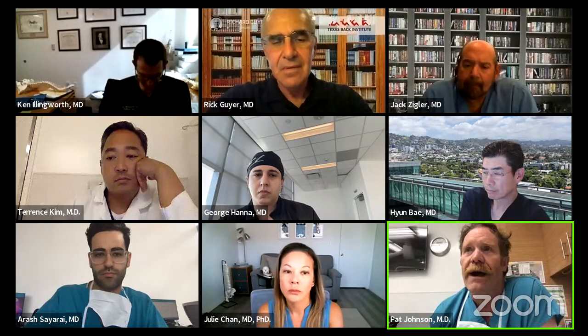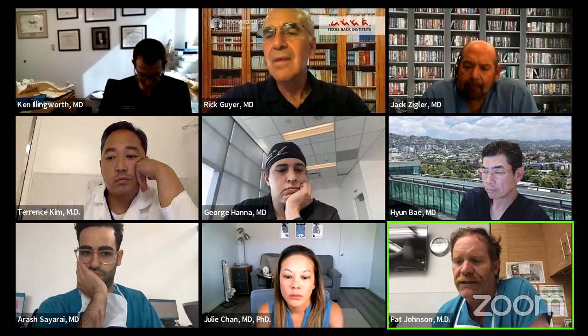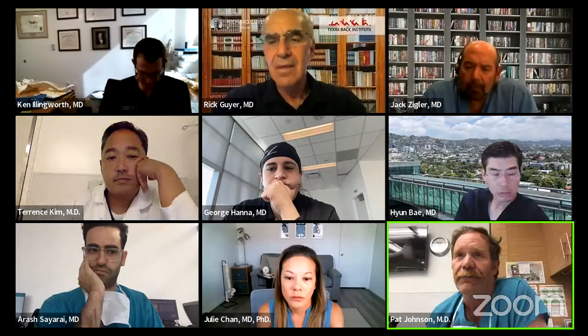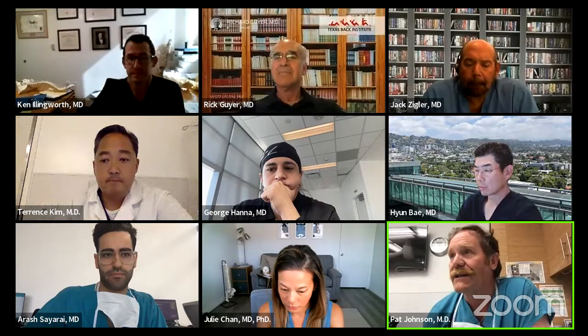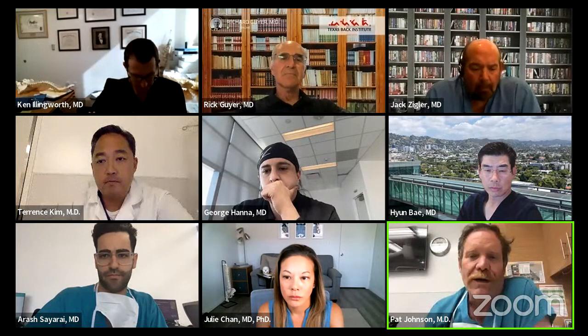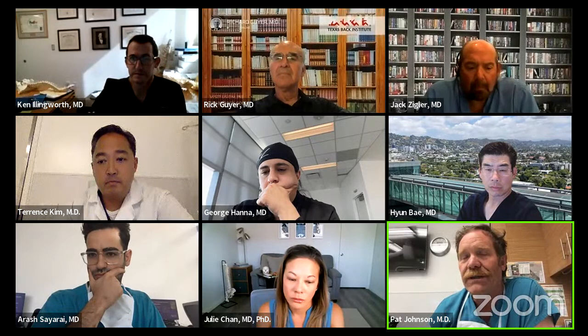I think the other big issue is that there's still a lot of controversy as to whether myelopathy is an appropriate indication for doing arthroplasty, which obviously I feel strongly about. A patient like this obviously has a huge disc osteophyte complex and a severe myelopathy. He's an athletic guy, a basketball player, and he's actually gone back to play some basketball, although he doesn't play competitively anymore. He's done well to the point that he came back for so few post-op visits. We don't have that many imaging studies on him. But he's 4 going on 5 years out, and he's doing quite well with this.